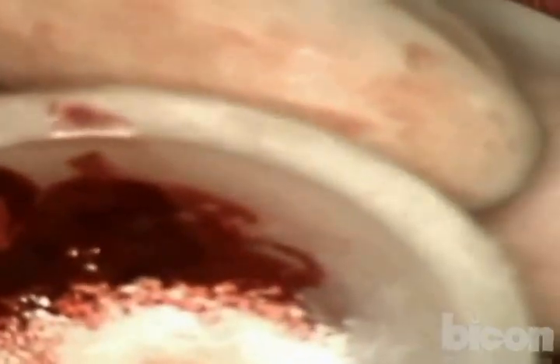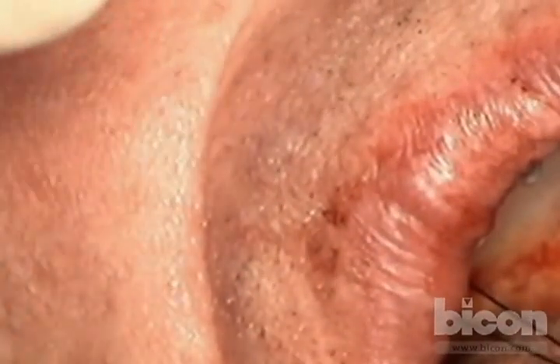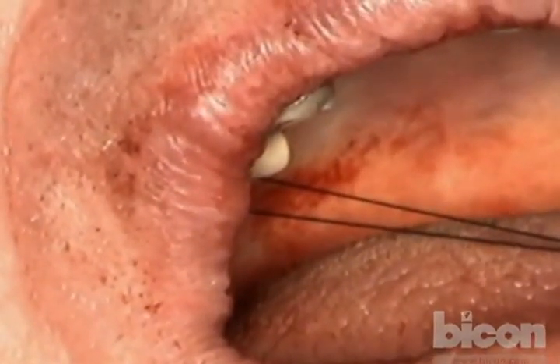Mix all together the blood we collected, the bone we collected, and the synthetic graft, fine, half a gram. We can churn the whole lot together. And instead of spending all kinds of time and money on PRP, we allow the coagulum to break into the bone graft particles, and by mixing them with significant force, we're able to create a sort of putty consistency. Okay, so I will keep mixing it now. We have to get to a good level.